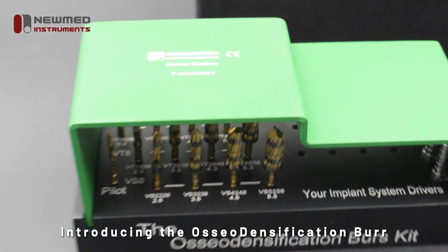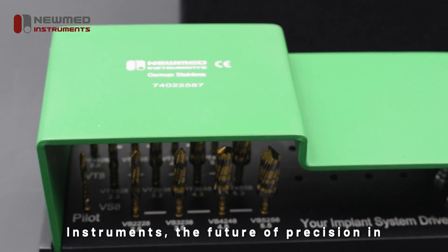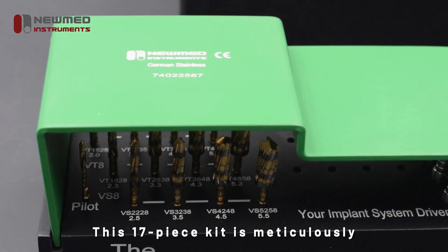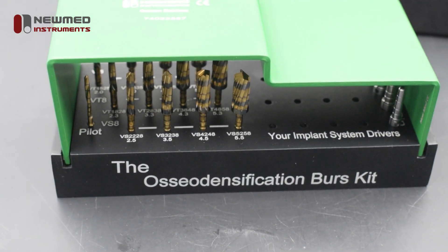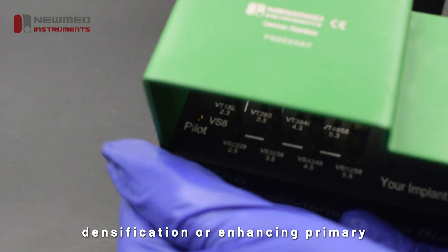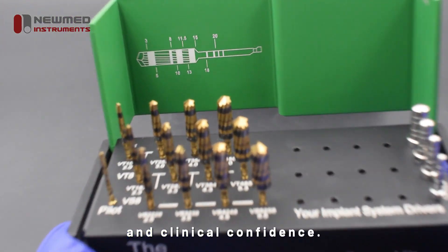Introducing the OsseoDensification Burr Drills Dental Implant Kit from NuMed Instruments — the future of precision in dental implantology. This 17-piece kit is meticulously engineered for superior performance, efficiency, and control in implant procedures. Whether you're working on bone expansion, densification, or enhancing primary stability, this kit delivers reliability and clinical confidence.